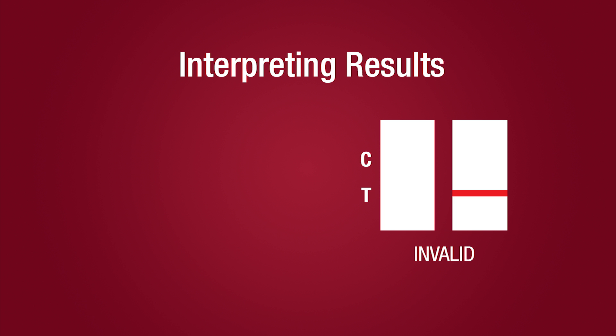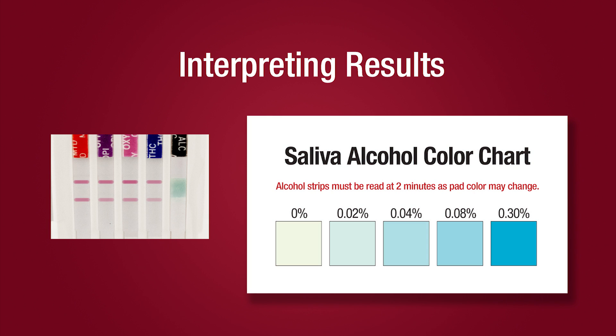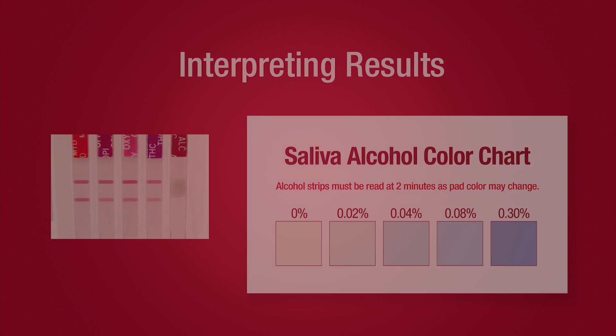If the device includes alcohol, read the alcohol strip at 2 minutes. Compare the color of the reaction pad with the color chart provided to determine the relative blood alcohol level. No color change indicates a negative result.